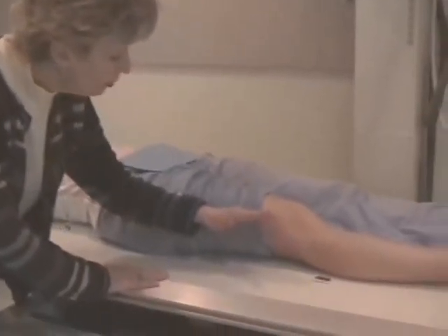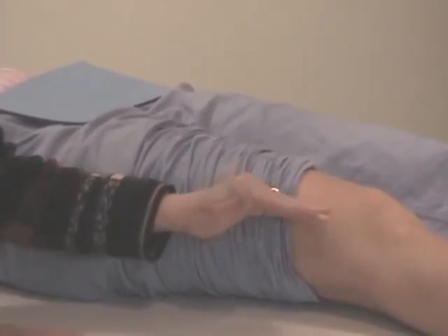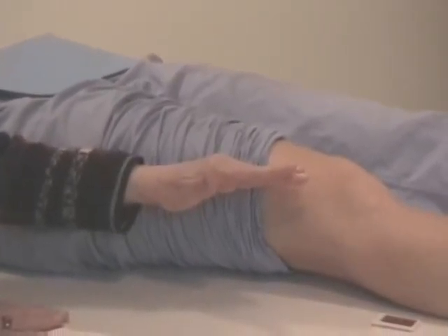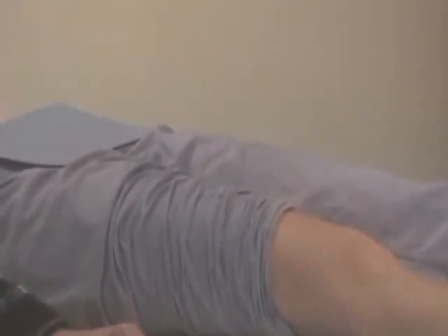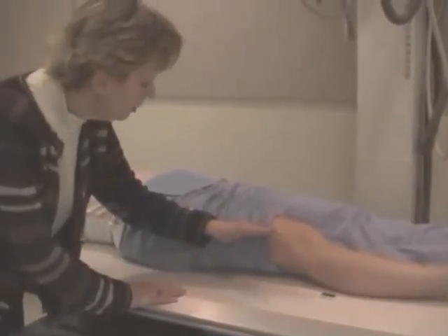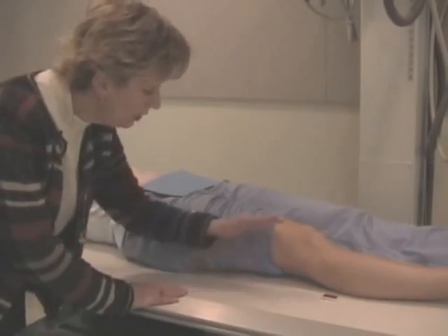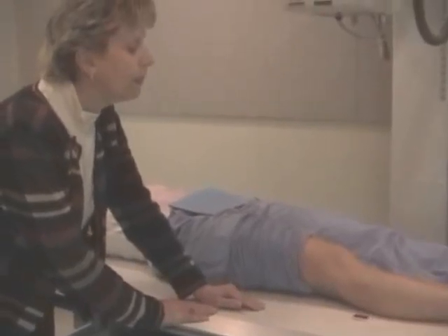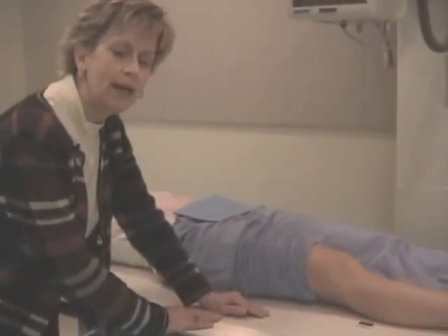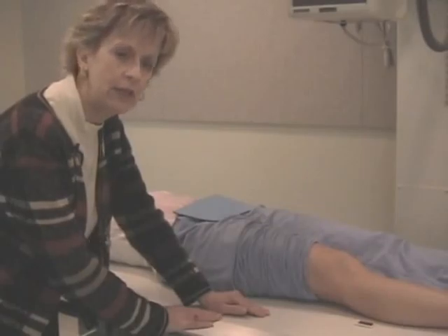Some patients, the femur might end up being a little angled this way. If the femur is angled this way, or the patient is small, the Ballinger text encourages you to angle the tube caudally 5 degrees. I consider Kristen to be fairly normal, maybe a little on the thin side, so I'm going to leave the tube perpendicular, or I might elect to put a caudal tube angle on there of a few degrees.